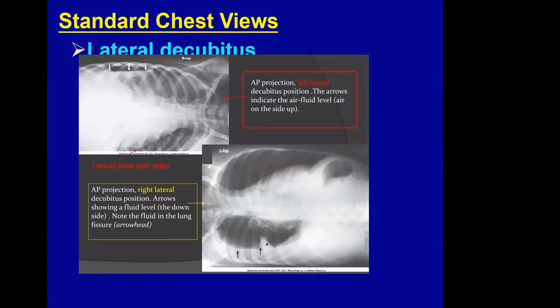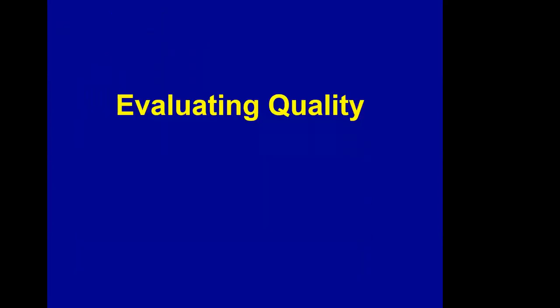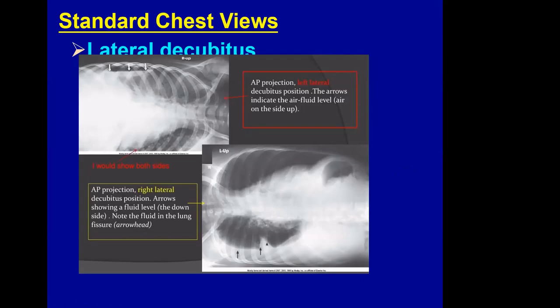Here is a lateral decubitus view. You can see the small black arrows on the lower radiograph showing a fluid level — a pleural effusion.